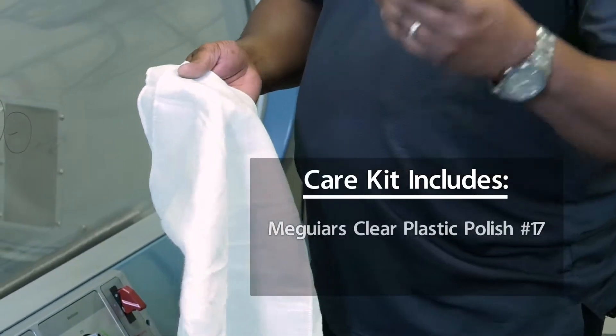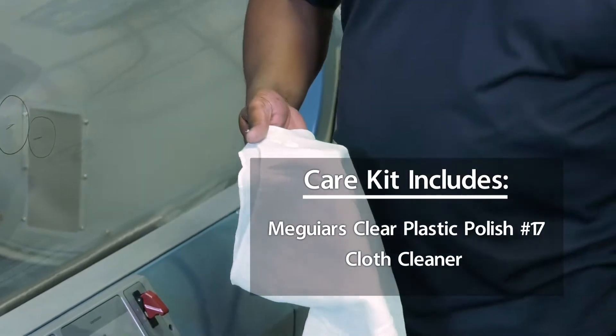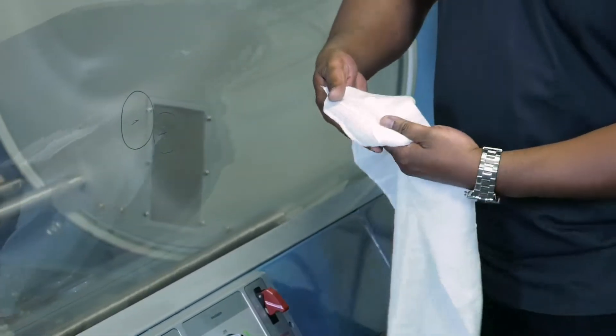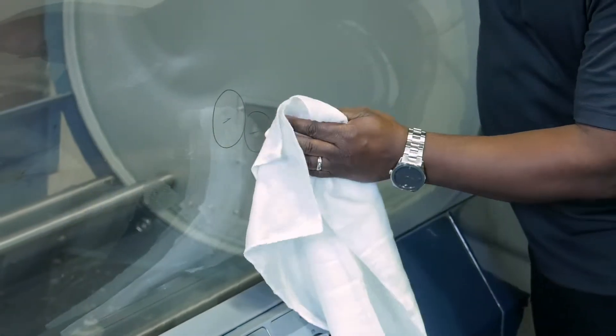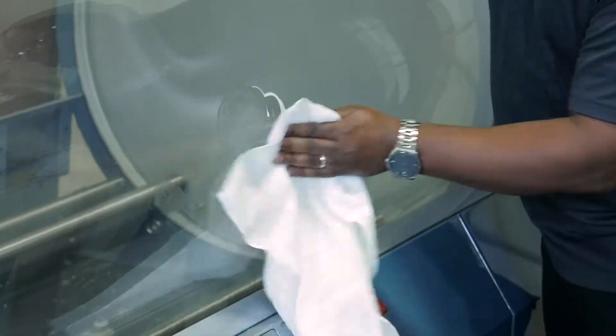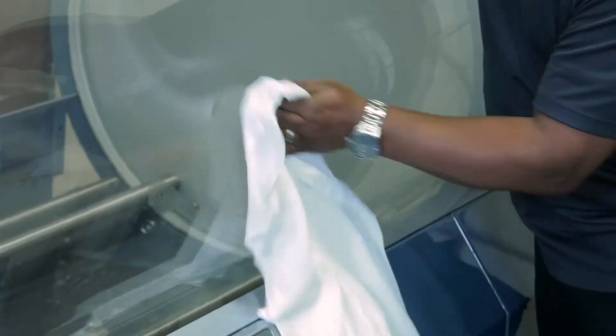The first step is to apply the polish to your polishing cloth. As you can see, we have a couple scuff marks here. You just want to go ahead and apply this in a circular motion, or you can go horizontal or vertical.